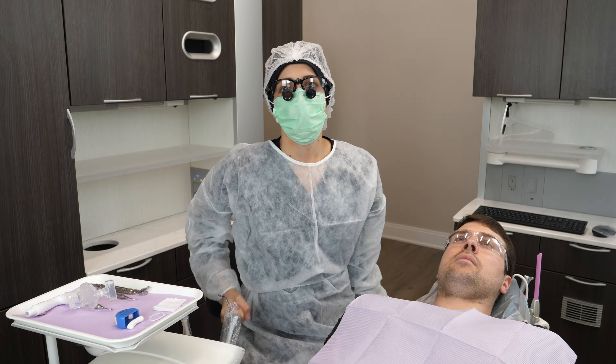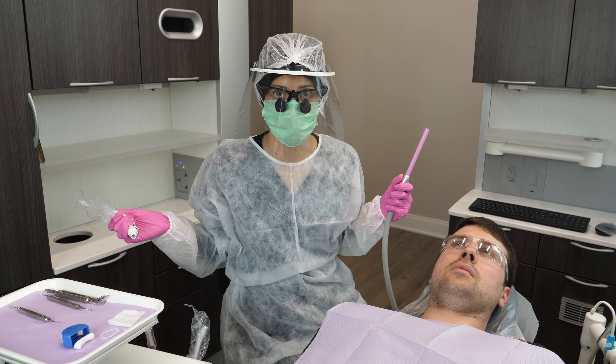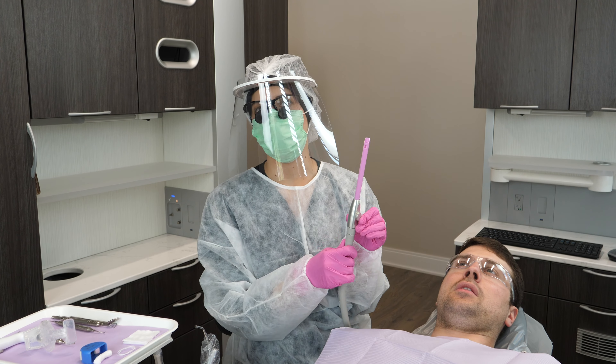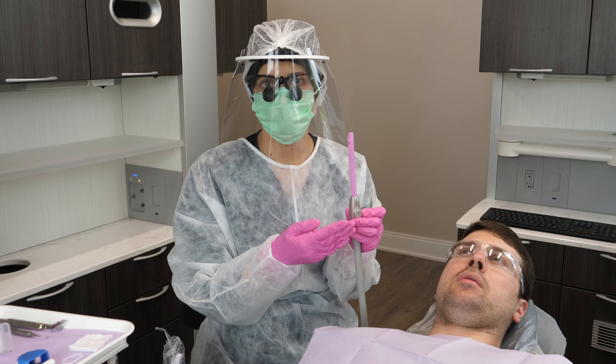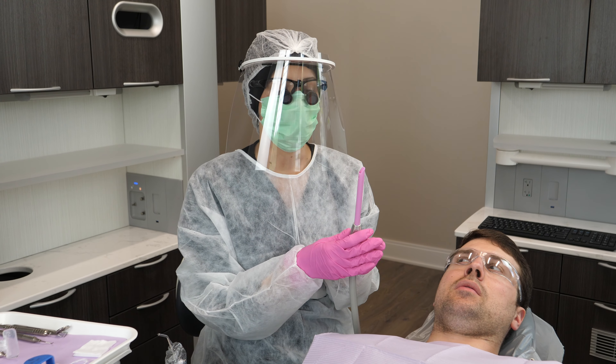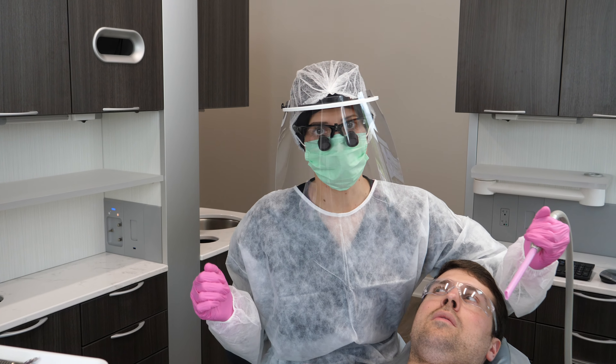So let's talk about the different high evacuation devices we can use during ultrasonic scaling and polishing. The first one is the HVE — the high volume evacuation. This is the high speed suction. We all know this one. It's super great if you have an assistant, obviously, but without an assistant it's not always ideal, but it's still possible.